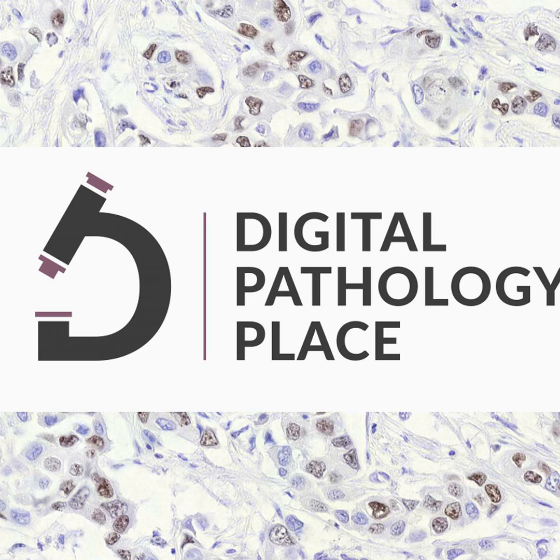And the AI, at least in radiology, most of the AI systems out there, they don't review every image on the study. It's very unlike a radiologist, it's unlike a human. So for example, a CT scan, maybe a CT scan of the abdomen and pelvis, has multiple different series. It has an initial scout view. It's got an axial thin slice view, an axial thick slice view, coronal and sagittal views, and bone images. It has maybe 5 or 10 different series. And we want to send the right one to the AI. The AI is actually only looking at one of those. So how do you make sure it's getting the right series and reviewing the right images?